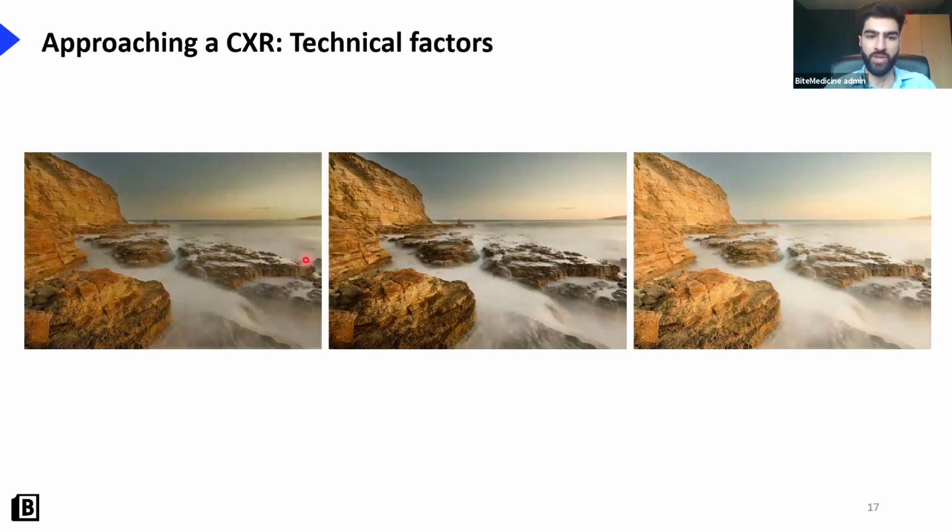Okay, so this is an example, and for those of you who do a bit of photography, you'll probably understand this a lot better than I do, but this is normal, this is overexposed, and this is underexposed. It's all to do with the amount of X-rays, or in this case, light that is passing through the camera lens and being picked up, okay?